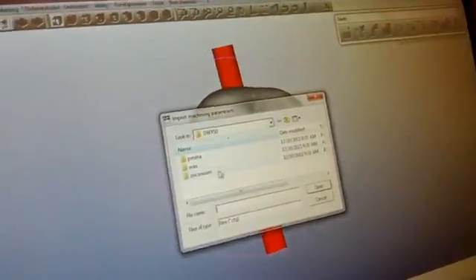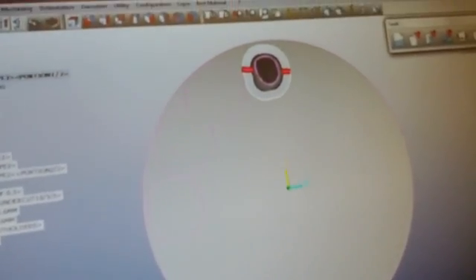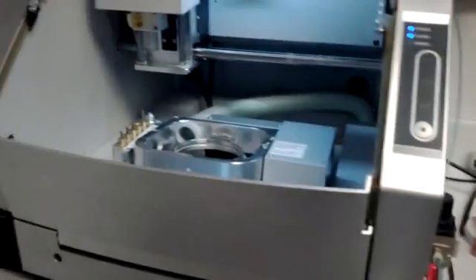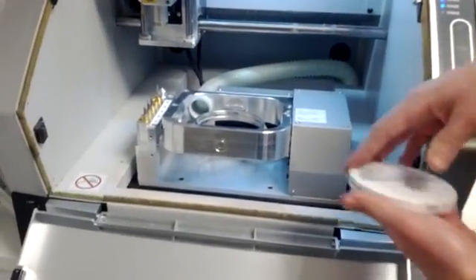One strategy. So now we're going to use a full contour zirconia strategy. Selecting some of the parameters here. Here we're selecting a puck that we've previously used. And we're placing this unit in the puck. Okay. So now we're going to put the puck into the mill.